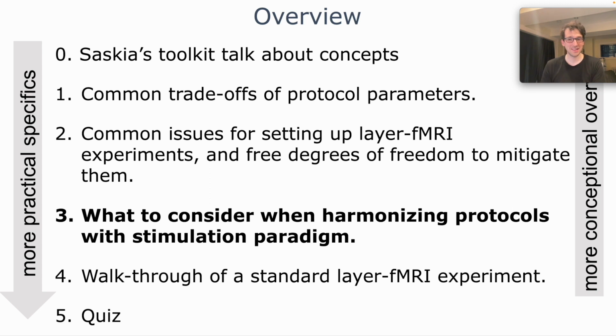And to be honest, I don't do checkerboards in block designs because I like to do boring neuroscience, or because I particularly care about how checkerboards are represented in the primary visual cortex, but simply because this is something that works, right?